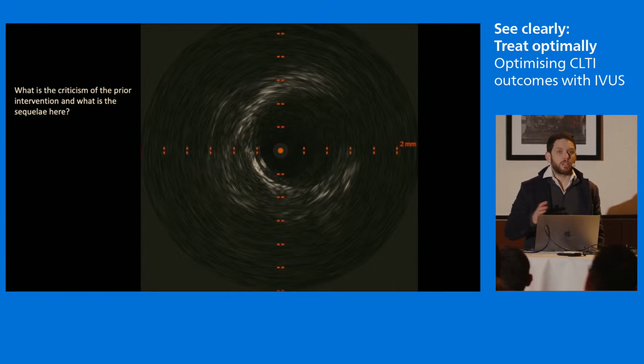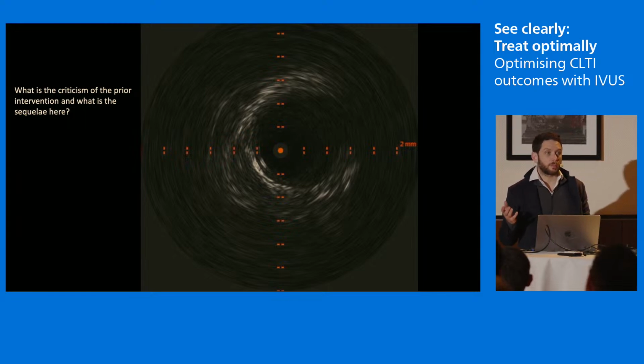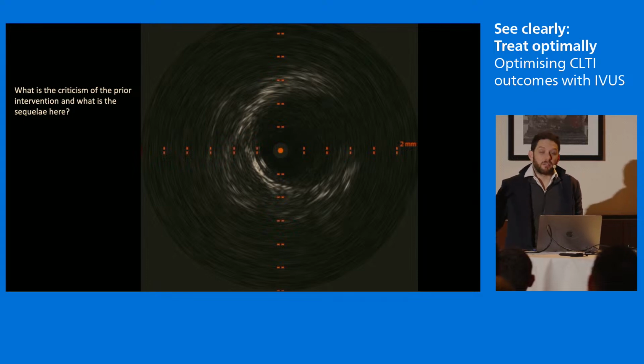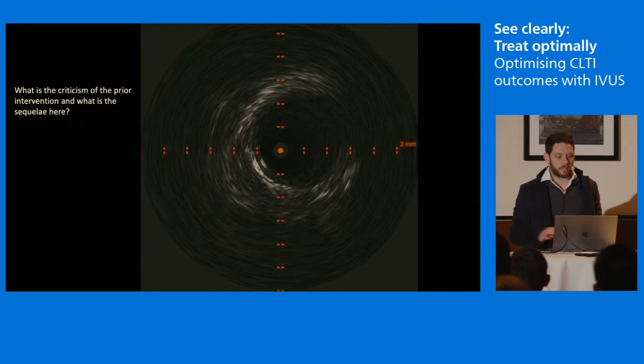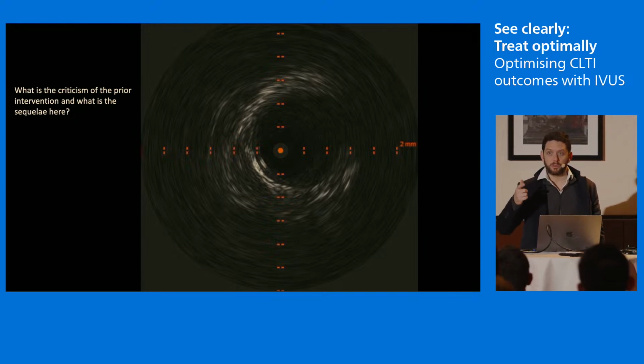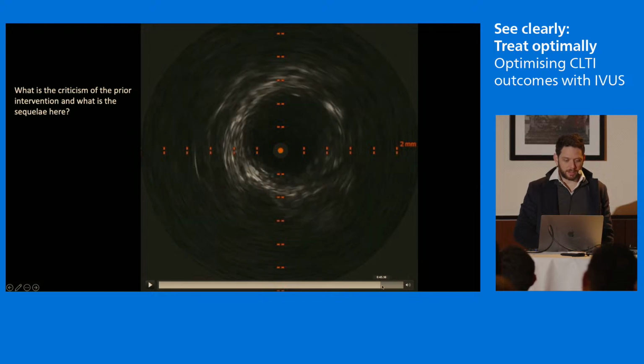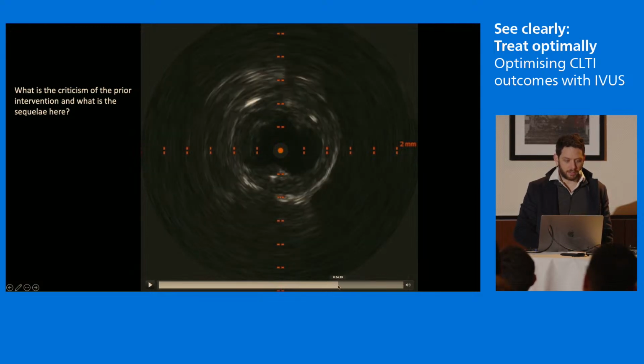I mean, majorly too small. But in a 70-year-old woman, a 7mm stent doesn't seem too unreasonable, right? Within the margin of error, 1mm here or there. But more than just an undersized stent, the error of an undersized stent is this process that you see at the bottom.